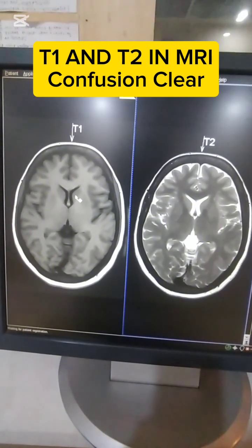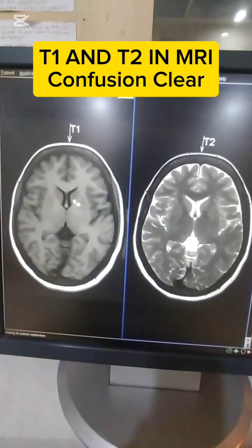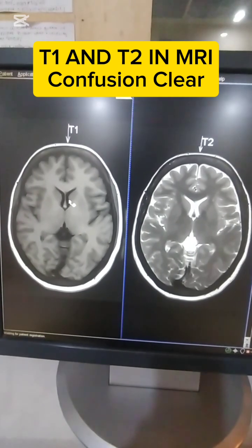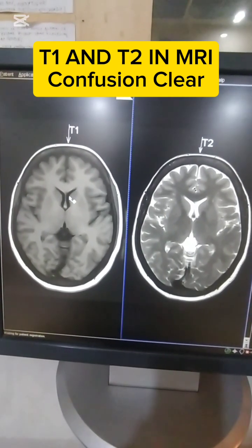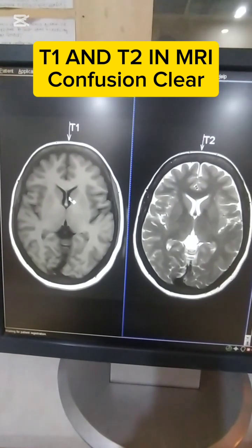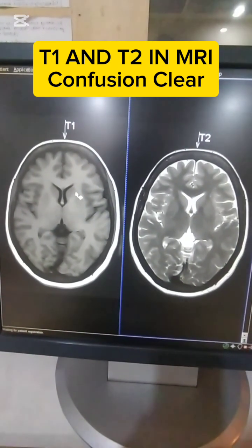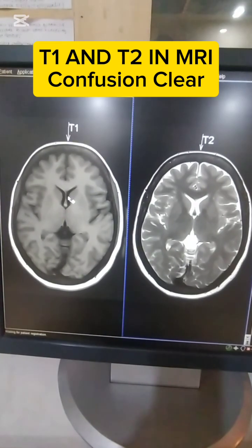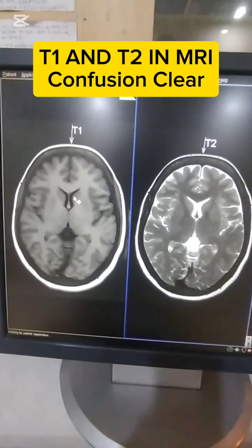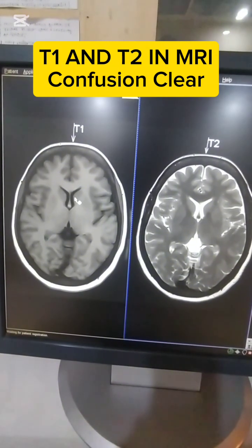In T1, the TR is short and the TE is also short. That means after giving the radio frequency pulse, if we take the image or receive the signal quickly, in a short time, then the CSF will be dark.